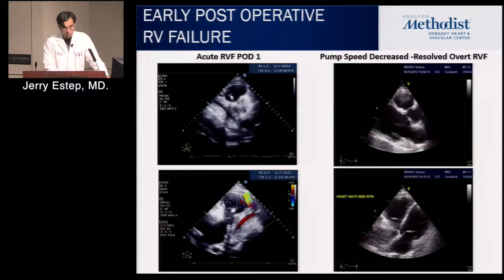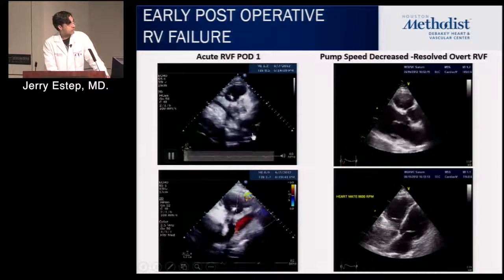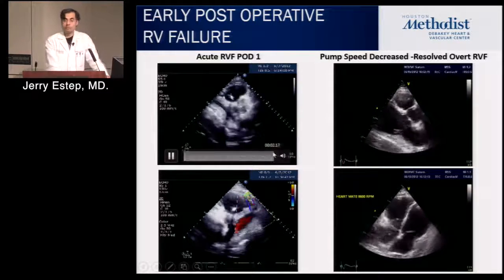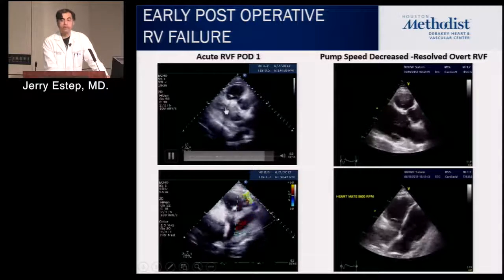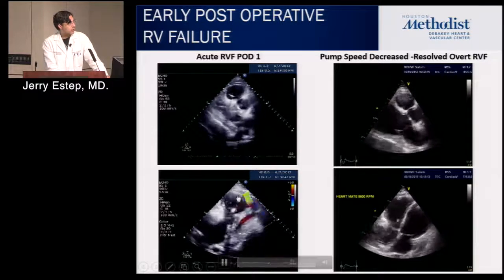And so this is the most overt example you'll see of what I would qualify as clinically meaningful RV failure. This is post-op day one. This is the LV. This is the RV. So a couple of observations. The LV is very, very small, underfilled. The RV is very dilated and depressed.